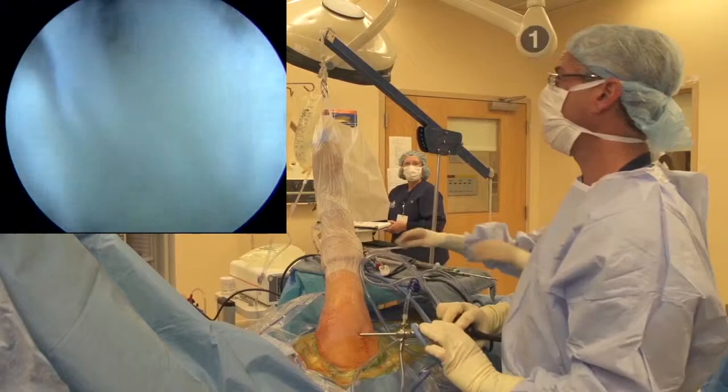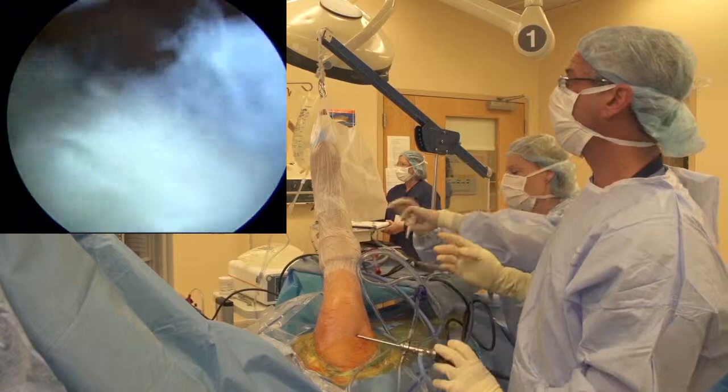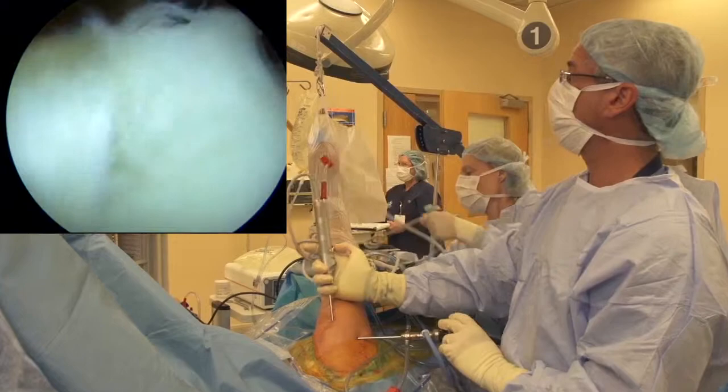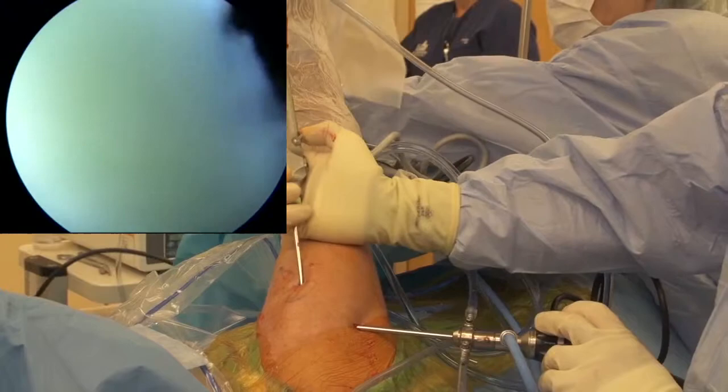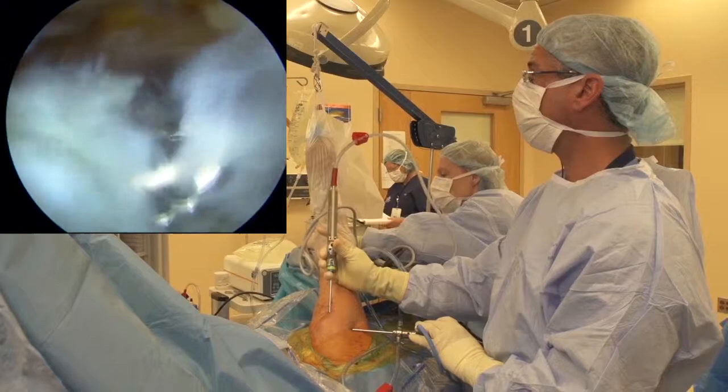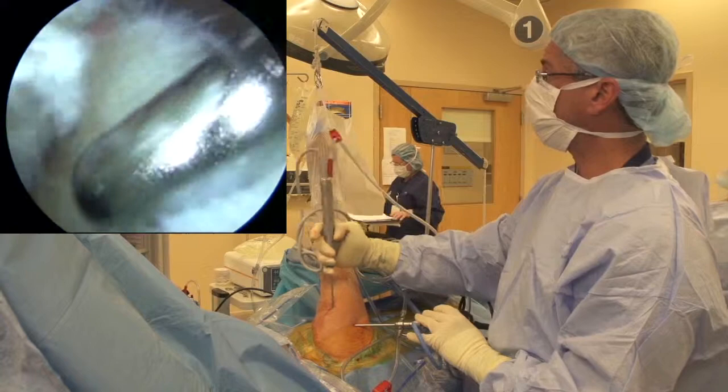I'll take a shaver now. The first thing I'm going to do with my shaver is start the process of preparing the footprint, removing any bursal tissue so we get really good adequate visualization of this cuff. And then we're going to proceed into our nanofracture technique to help us develop a good bony bed. We can see here the undersurface of this rotator cuff. There's some necrotic tendon which I'm going to go ahead and excise so we can get the better tendon to come back down onto the bone. And now we can see our footprint very nicely.